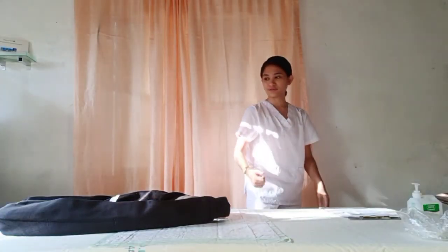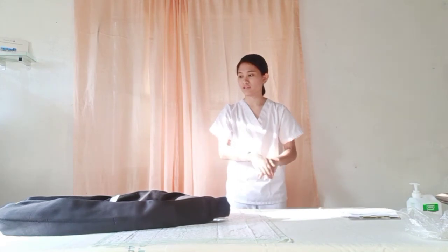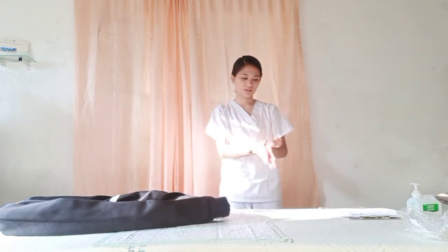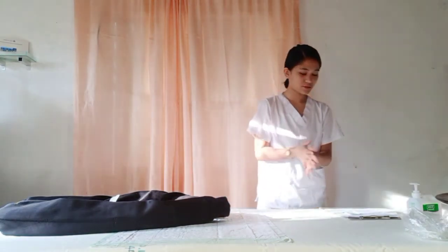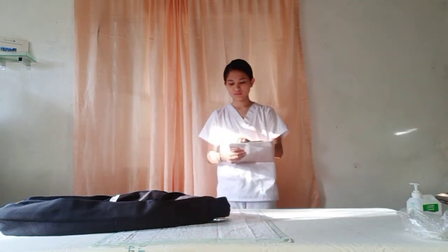How are you doing, Mrs. Cruz? Do you feel any discomfort? Okay, that's good. So now I'm going to proceed to the documentation. Once done with the documentation, you are good to go. And that is how you perform a urinary catheterization.